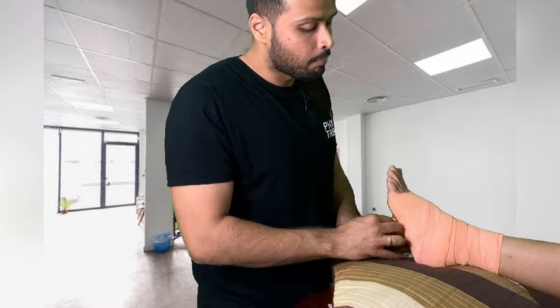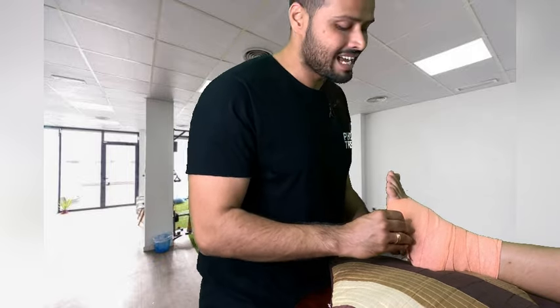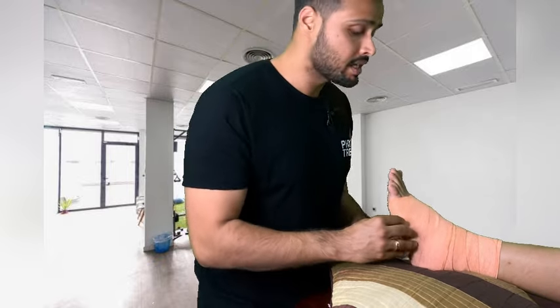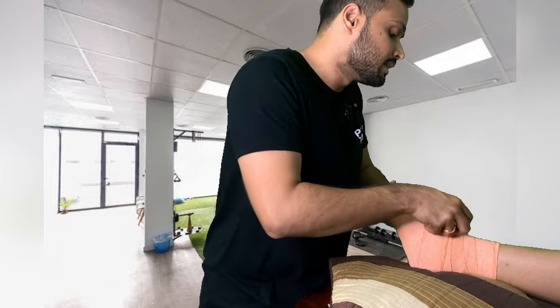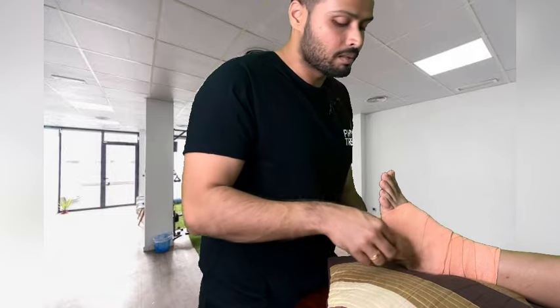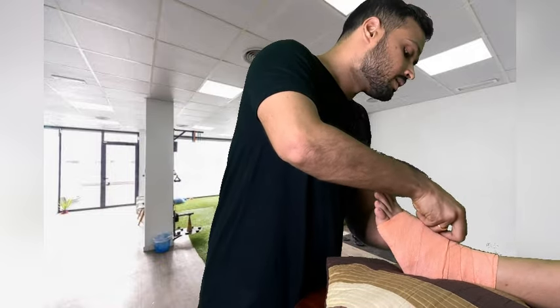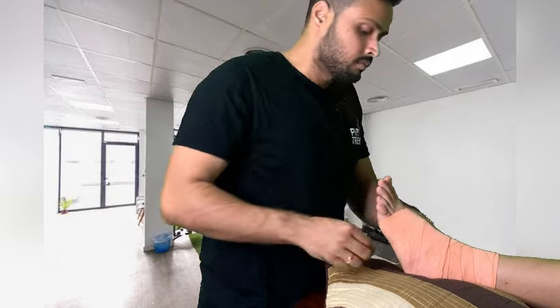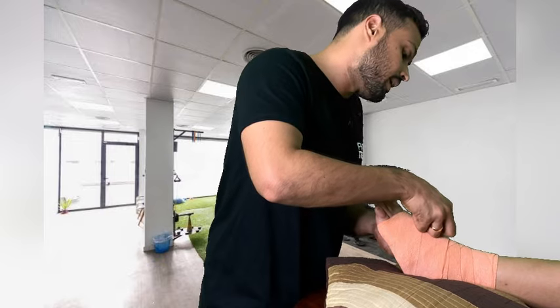Once you have wrapped it properly, make sure it does not end on the downside. If it is ending on the wrong side, just take one more wrap and end it in the upward direction, then clip it with the help of clippers. Also make sure the clip is not damaging or hurting the patient while you are applying it.